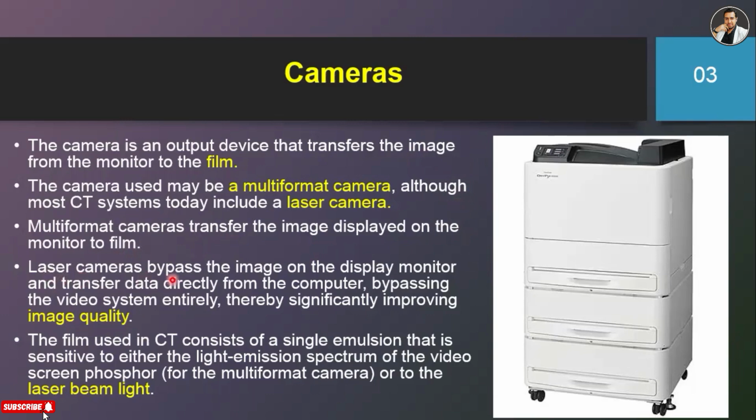Laser cameras bypass the image on the display monitor and transfer data directly from the computer, bypassing the video system entirely, thereby significantly improving image quality.